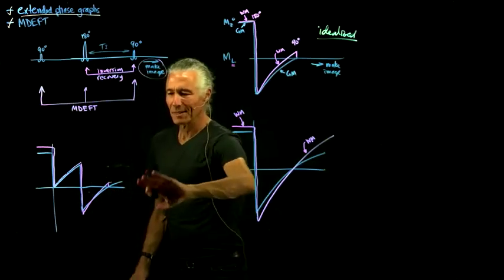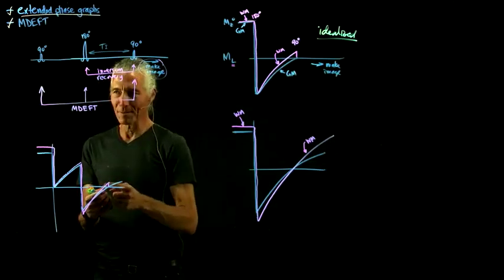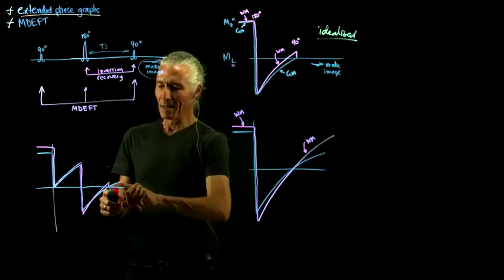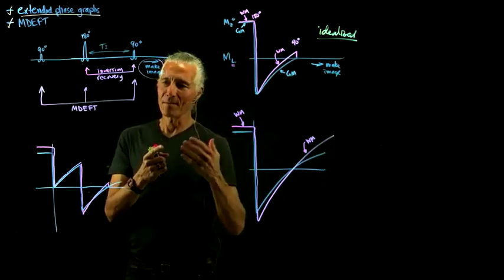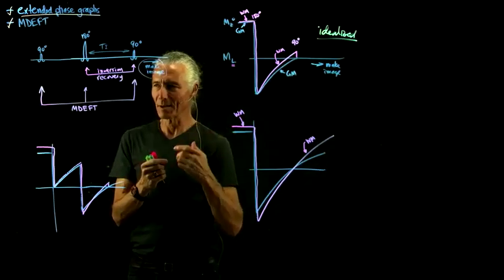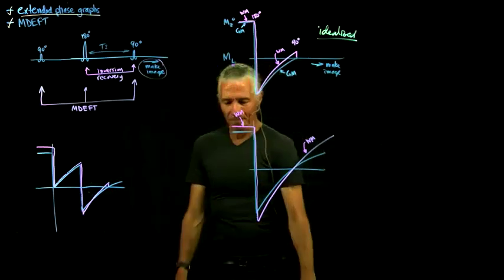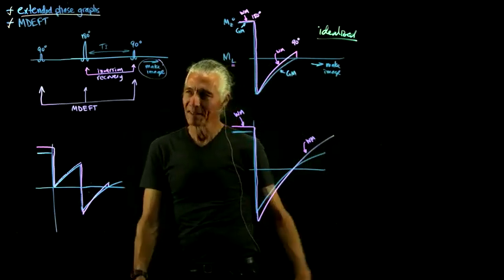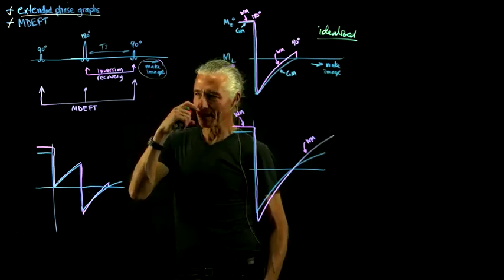So when you look at this, there's all these little small differences, but that's all that matters, because if you don't have any difference between the tissue types, then the gray matter and the white matter look exactly the same, and the image is completely useless if you're trying to distinguish gray and white matter. So this is kind of assuming some stuff that we haven't talked about yet about how you actually make the images, but just gives you some idea.